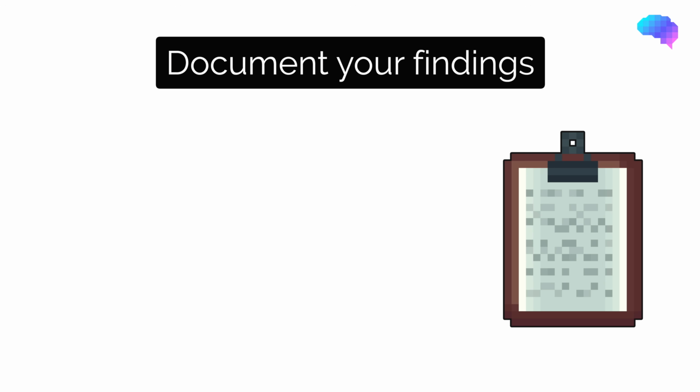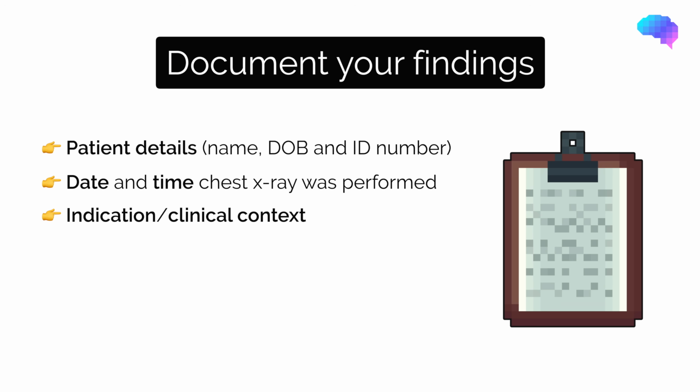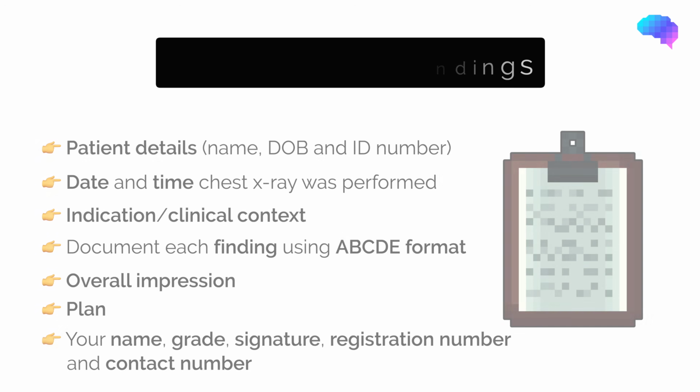To do this, you'll need to ensure you include the patient's details, the date and time the chest X-ray was performed, the indication and clinical context necessitating the X-ray, the findings from the X-ray, your overall impression, your plan for managing the patient, and finally, your name, grade, signature, professional registration number, and contact or bleep number.